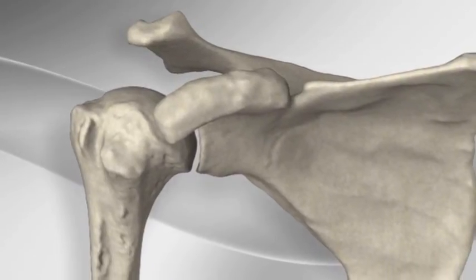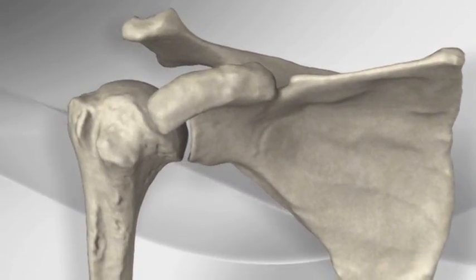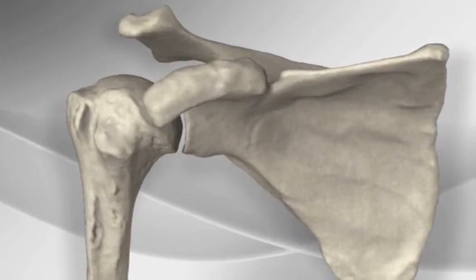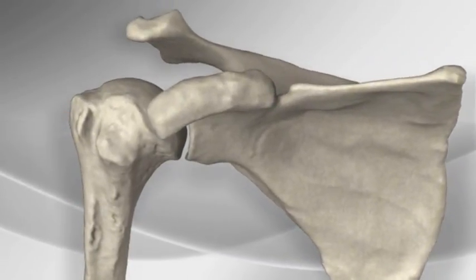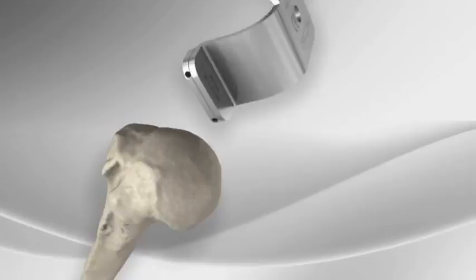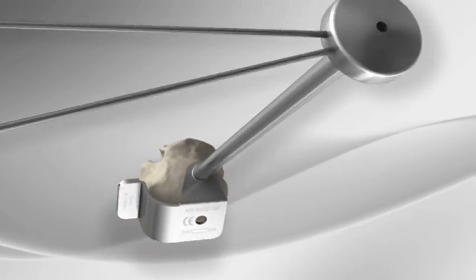The Universe 2 Total Shoulder is a device designed to treat osteoarthritis of the shoulder by replacing the degenerative portions of the shoulder joint. The surgeon begins by exposing the shoulder joint.